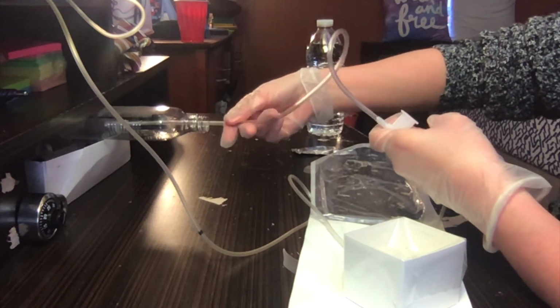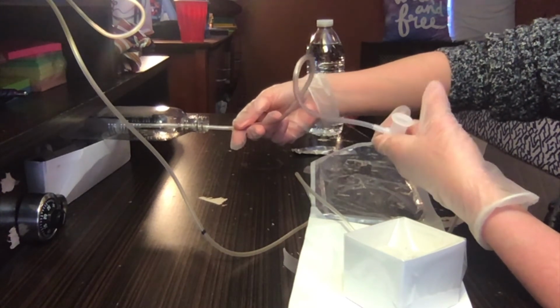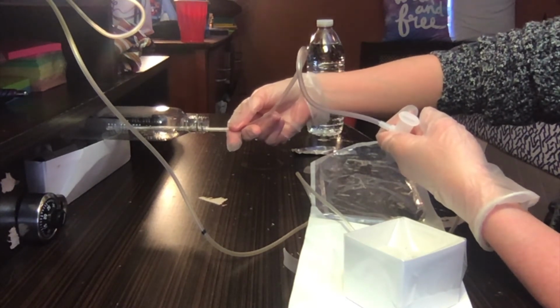So now that I'm in, I can start suctioning. And you want to suction in intervals. You don't want to suction more than 10 to 15 seconds at a time. Quicker suction times may effectively clear the secretions.